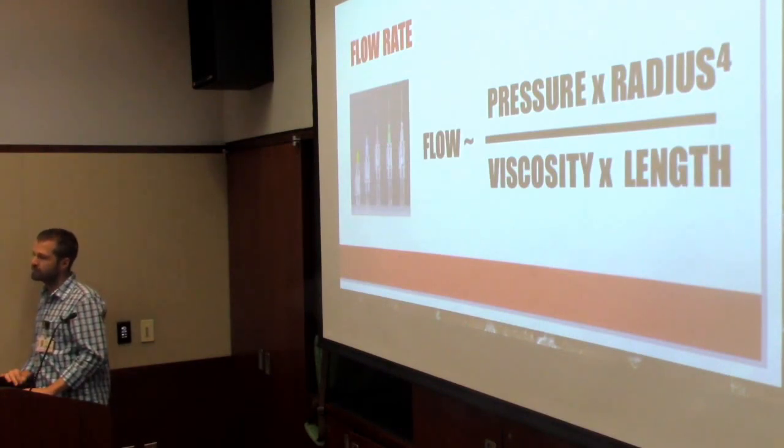Central lines, triple lumens, are a bad way to resuscitate people because they are really long. You put a sheath introducer in because they're the biggest thing that's going to completely swamp any length issues. But if your purpose of gaining access is to get fluid into a person, you don't want a triple lumen. And if you think, well, maybe they'll need a triple lumen, they can do that in the ICU. But don't put that triple lumen in to resuscitate them. Put it in the peripheral line, put the fluid into the peripheral line, and then if you need access for pressors, you can put in the triple lumen also or later.